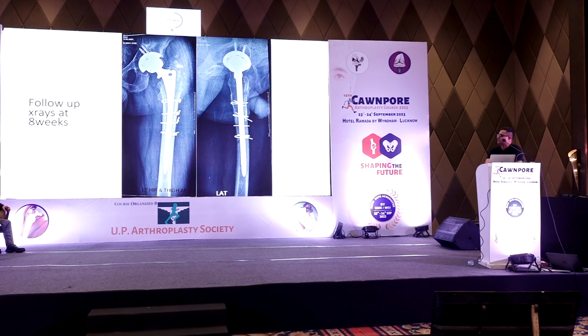Number two, if you look at the position of the screws there, if you compare the established screws from the first X-ray, I don't know whether it's rotated. We are not able to comment whether it's rotated, whether it's changed position, but obviously the screws have changed position. And it would not be advisable, especially in a patient with that mobility pattern, to leave the acetabulum without additional fixation, especially when you suspect a fracture. Either it should have been revised or it should have been anchored with additional fixation.